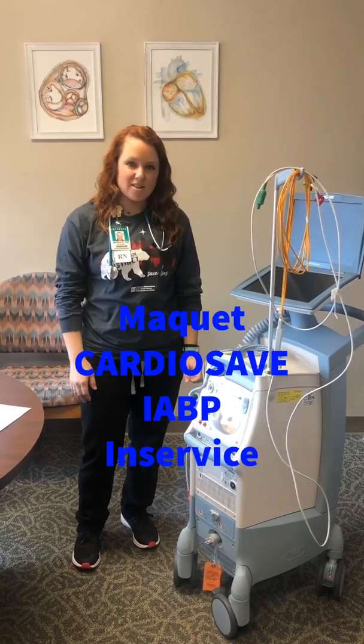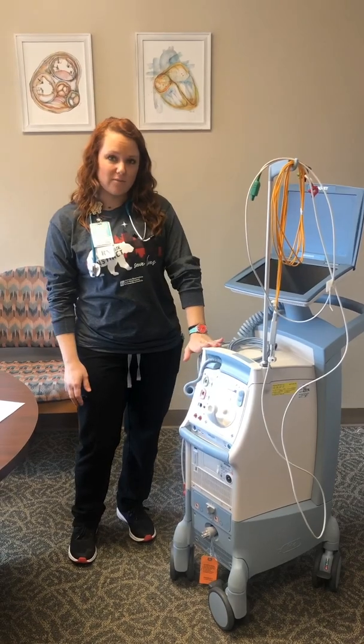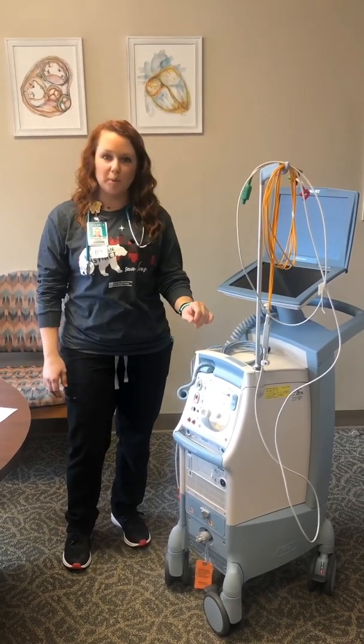Hi, my name is Melissa. I'm a nurse in 801 and I'm going to be going over the Cardio Save, which we are switching over from our old balloon pump.